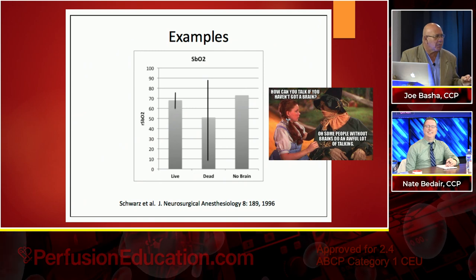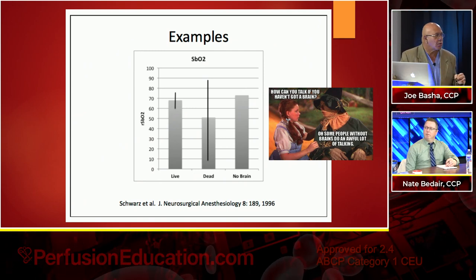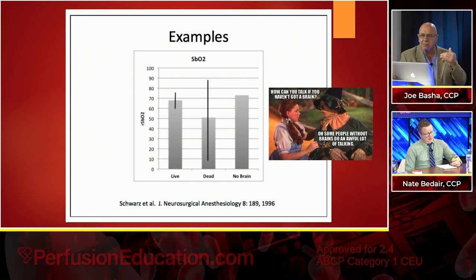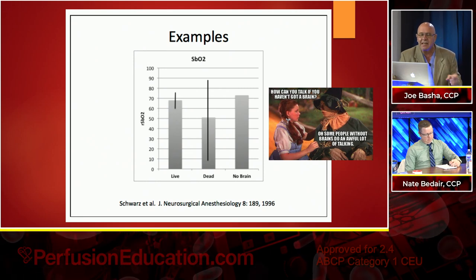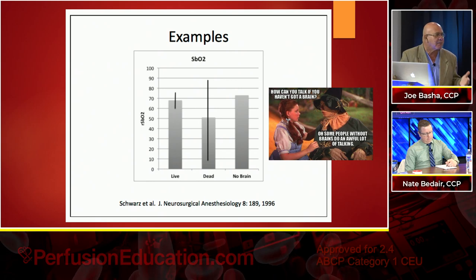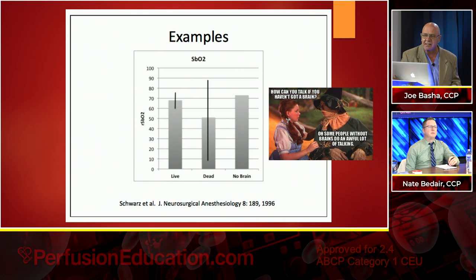So for cerebral oximetry, there was a really good article done some time ago called Pumpkin or Patient, because they put the cerebral oximeter on a pumpkin with a candle in it, and they were getting readings consistent with a living patient. This study came out of Schwartz. It was written in 1996.